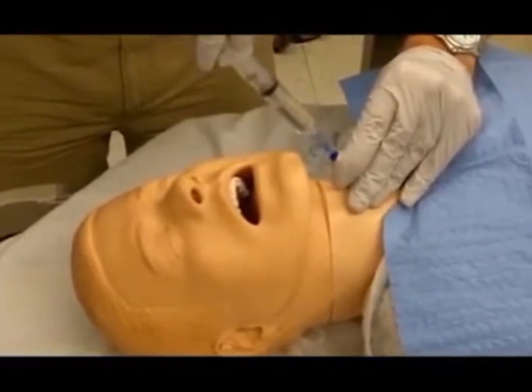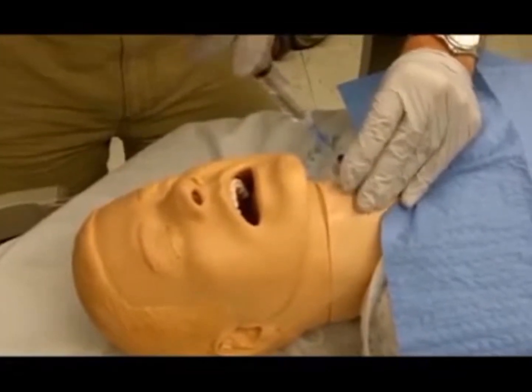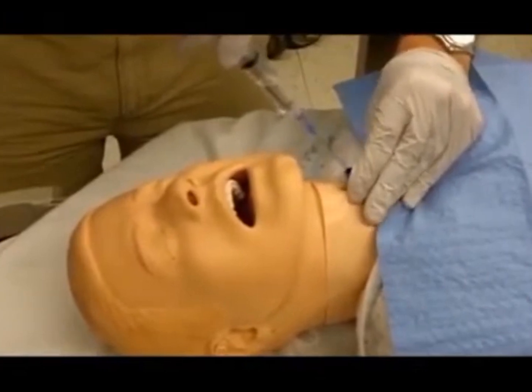Advance the needle and catheter a few more millimeters and then gradually withdraw the needle while advancing the catheter until the hub reaches the skin.